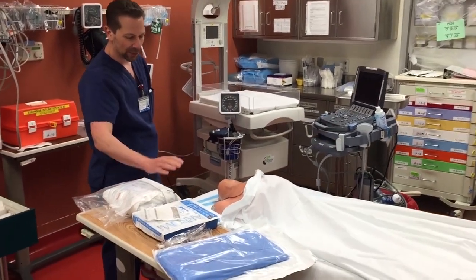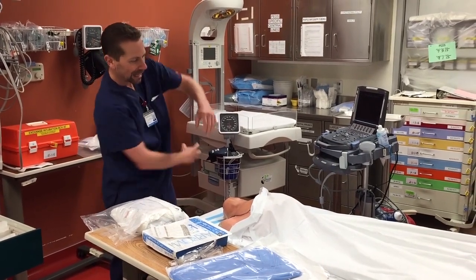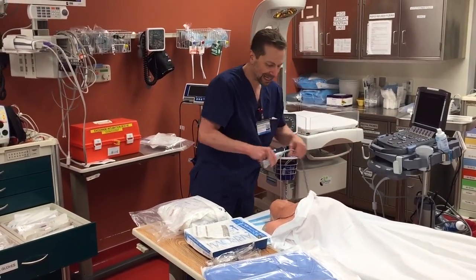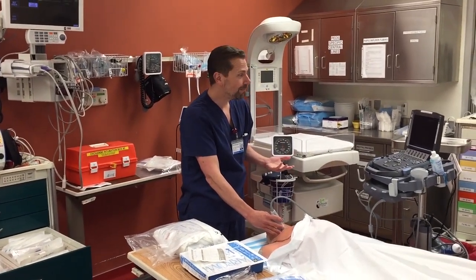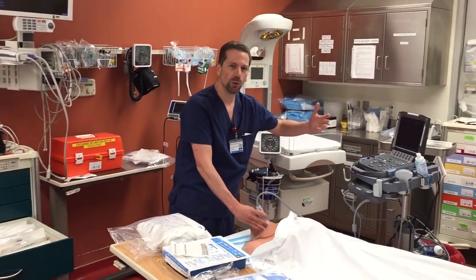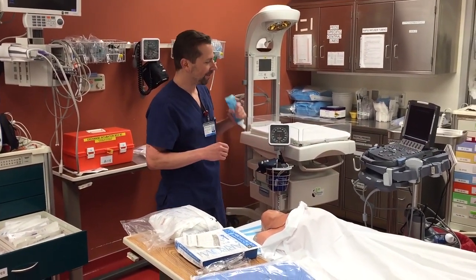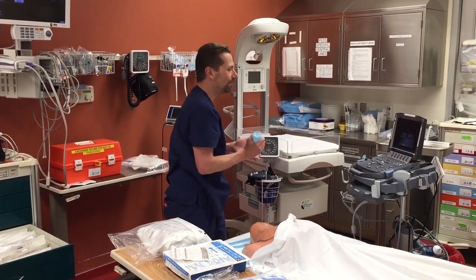There should be a table positioned at your dominant hand so you can actually reach for this stuff. Before you start the procedure, you should ultrasound your site and make sure that one, the vessel's patent, but just as importantly that the depth and gain settings are what you want, because once you get sterile that's not going to be possible for you to do on your own. The goal here is that you should be self-sufficient on lines. Put a big blob of gel over the probe at that point.